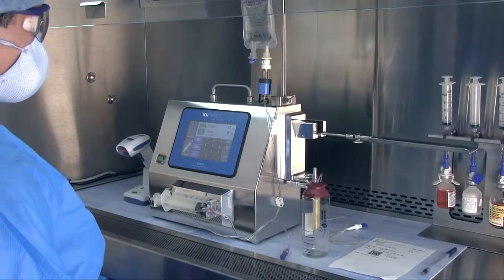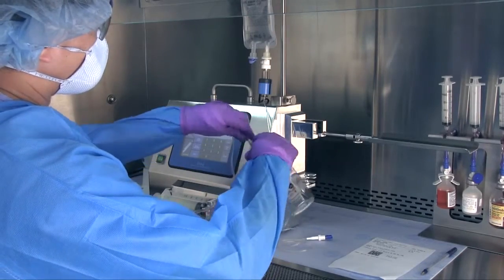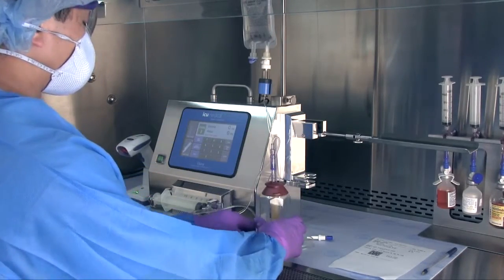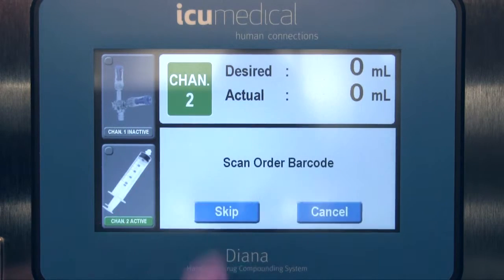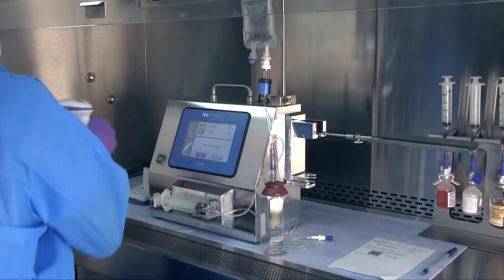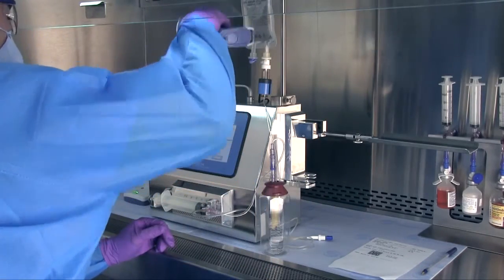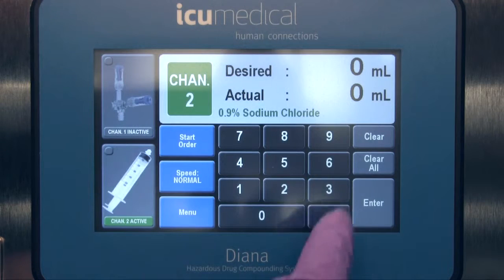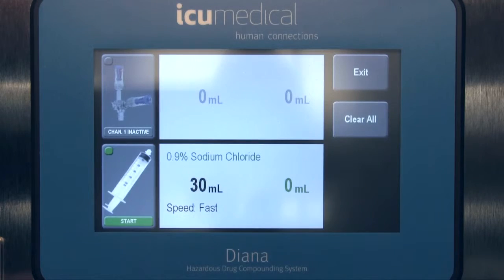To operate Diana using Channel 2, select a diluent set to attach to the hanging fluid bag. Once the Channel 2 diluent set is properly connected, simply select Channel 2, press Start Order, scan the patient order, scan the medication or diluent bag, select the desired volume, and confirm that the correct medication, volume, channel, and patient container are being used and that the preparation matches the patient order. Then press Start.